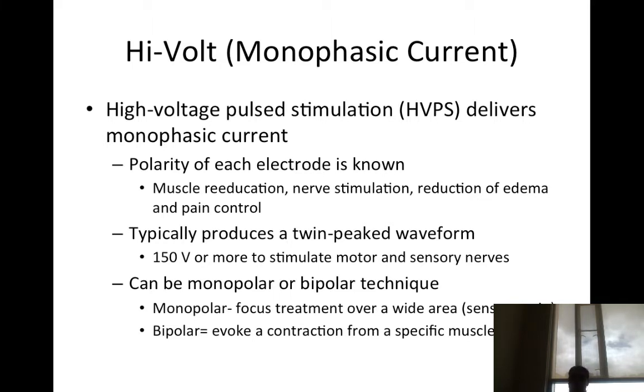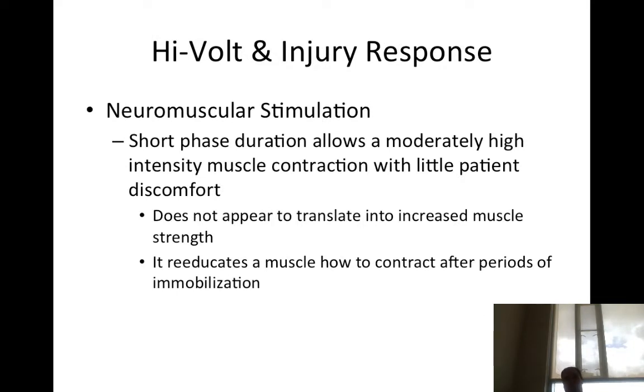And this can actually be used as a monopolar or bipolar technique. The monopolar focuses over a wider area, and that's used more for sensory pain. Versus bipolar, we're evoking a contraction from a specific muscle. We use that more for a motor level contraction, right?